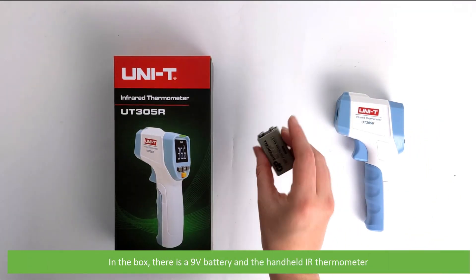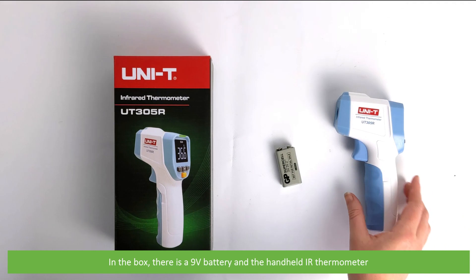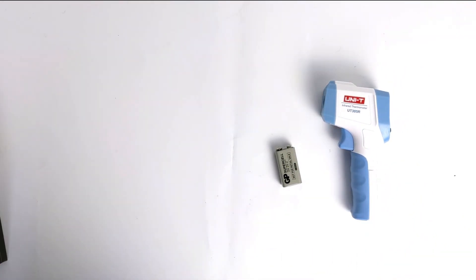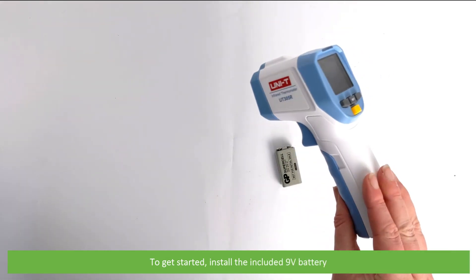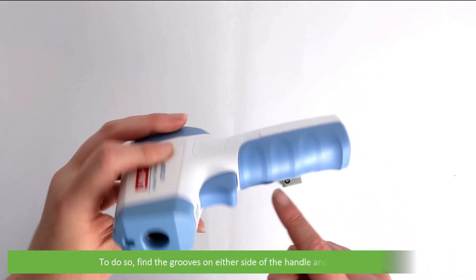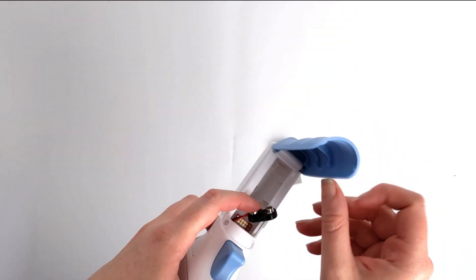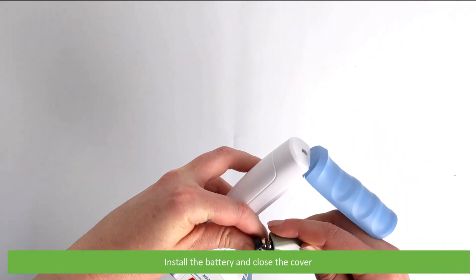In the box there's a 9 volt battery and the handheld IR thermometer. To get started, install the included 9 volt battery. Find the grooves on either side of the handle and pull to open, then install the battery and close the cover.